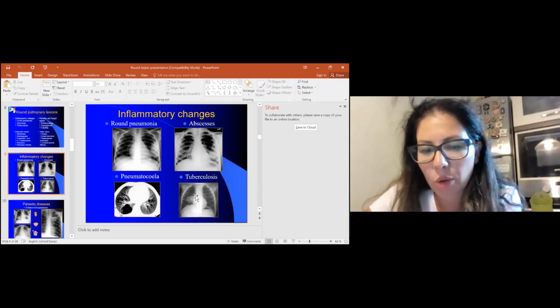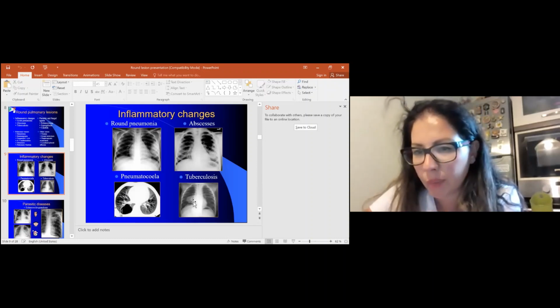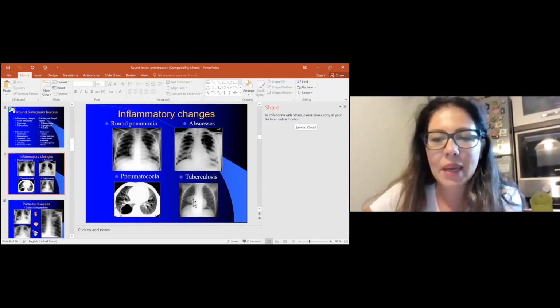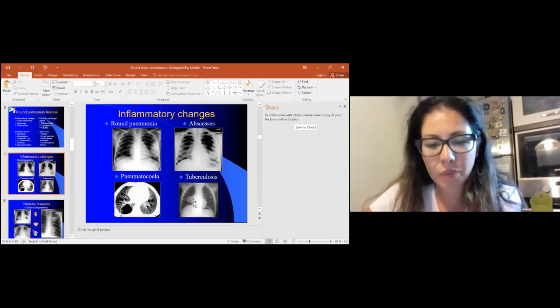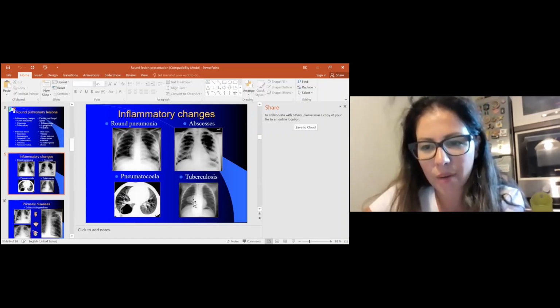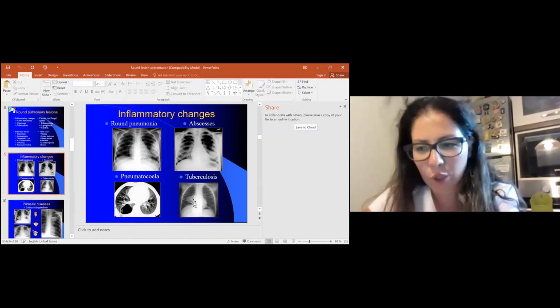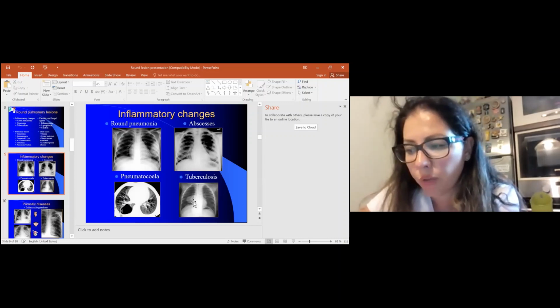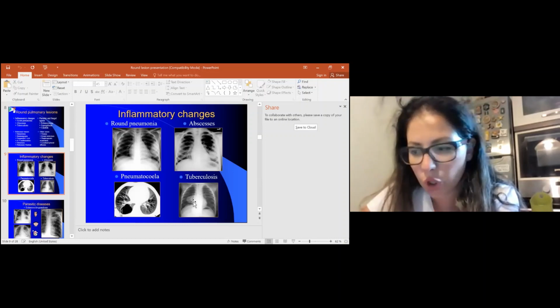And tuberculosis. This is primary tuberculosis, and our country is also an endemic region, even though the vaccination is high, maybe 90% and more. Primary lung tuberculosis in children may not have a pathognomonic radiographic presentation, so we need additional laboratory, microbiology, and epidemiologic or socioeconomic factors of the child.